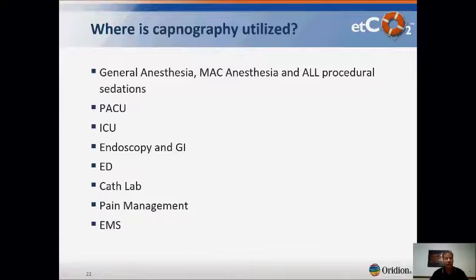Cath lab, usually the patient's awake in a cath lab, and that's considered conscious sedation because they're sedating them and doing a procedure. So they'll use CO2 monitoring there.